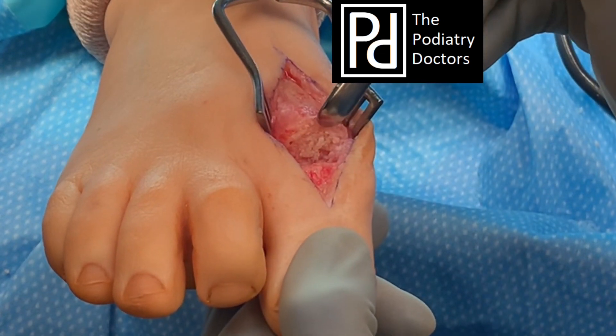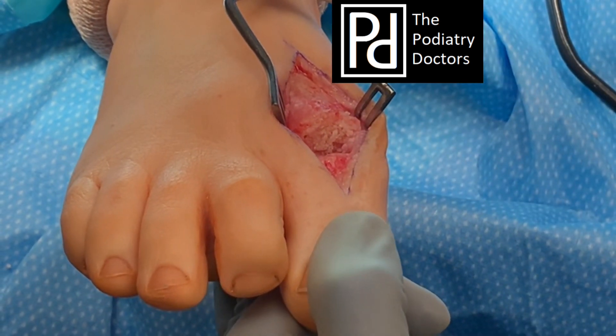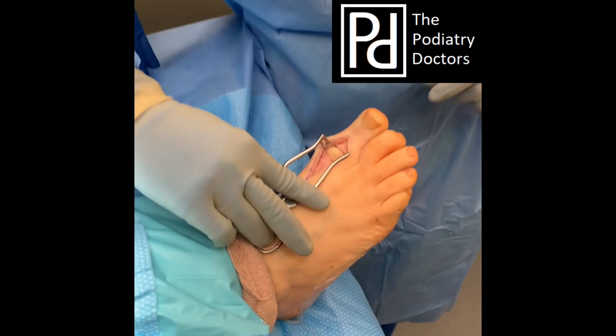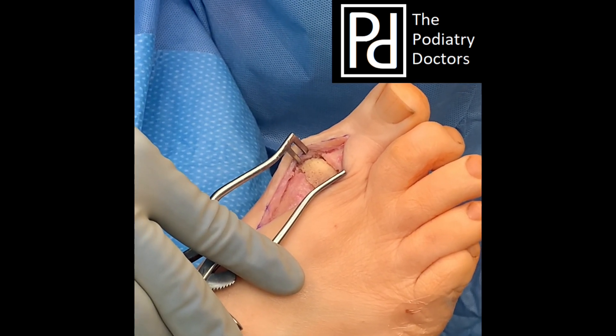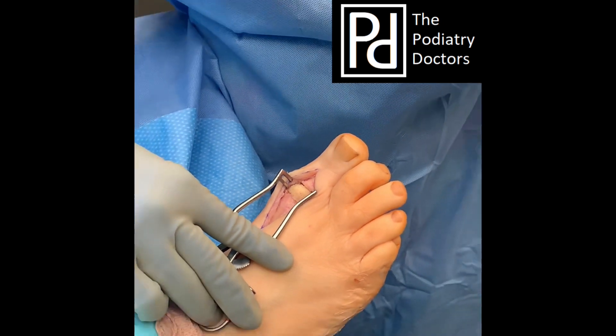We have backfilled the medullary canals of both the first metatarsal and the proximal phalanx with bone chips. We are getting ready for the bone block. We can see our piece of allograft provided by Paragon — fits perfectly into our void. We have the toe nice and rectus and that bone void filled.